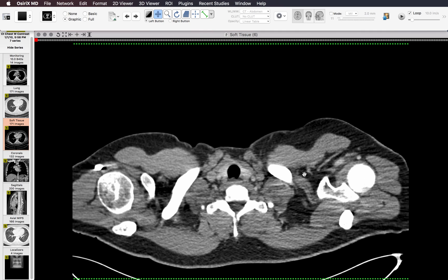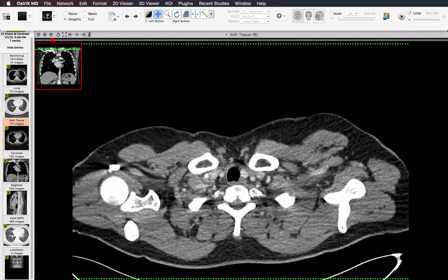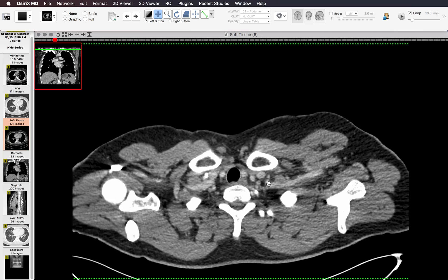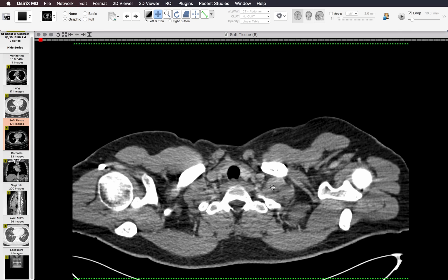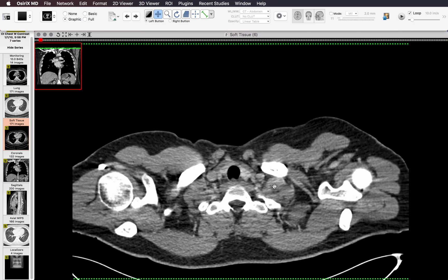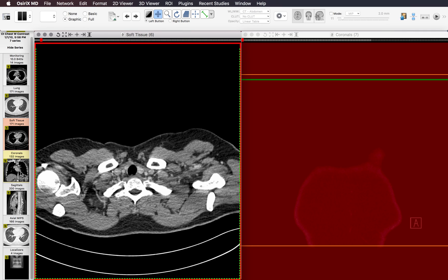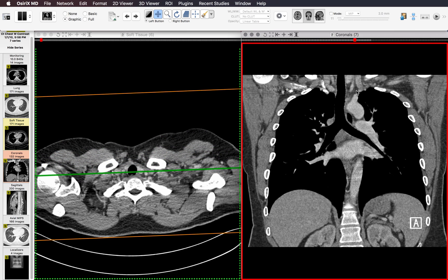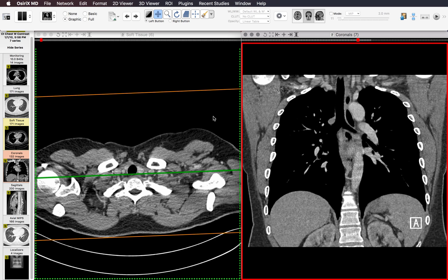The next thing I do is look for lymph nodes. The supraclavicular region can be tricky because there are a lot of vessels coursing in and out of the area, and you have the scalene muscles which can be confused for lymph nodes. It's important to scroll up and down and take your time in this area to make sure that what you're calling a lymph node is not a muscle or a vessel. You can use your coronal images to help — vessels will show up as vertically oriented structures and lymph nodes will show up more as nodules.